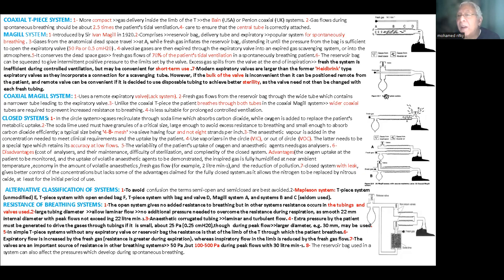Of course, whenever I tighten the expiratory valve to use it for controlled ventilation, the situation which we mentioned before, where the alveolar gas has been expelled, will be completely changed, and the constituents of the gas in this expiratory limb will be changed, so that it will not give us a proper mode of ventilation, where there will be some sort of rebreathing. This is why we ought to use this system for controlled ventilation for only a short period.